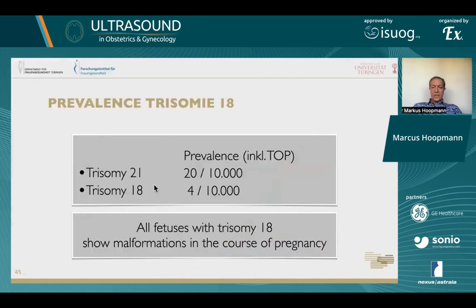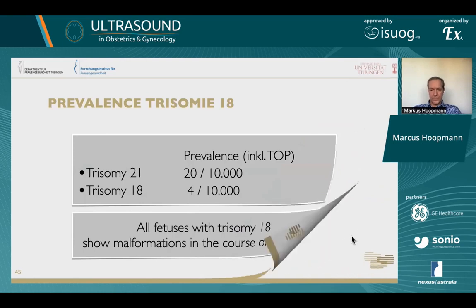So it's much rarer than trisomy 21, but what we can say is that all fetuses with trisomy 18 show malformations in the course of the pregnancy. So here, the ultrasound gives us the way to see what we have to look for.